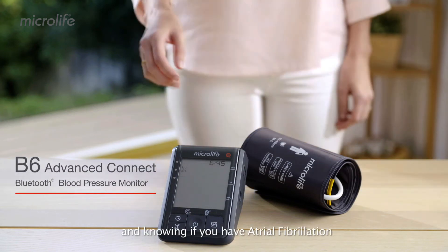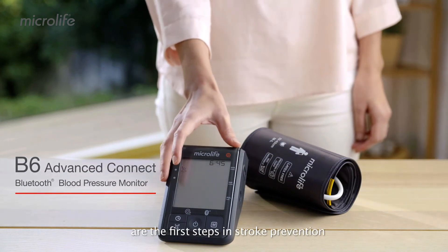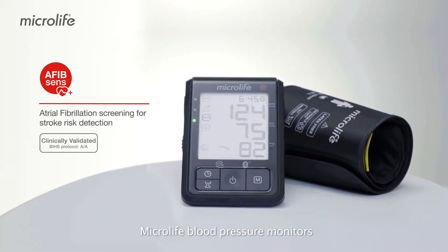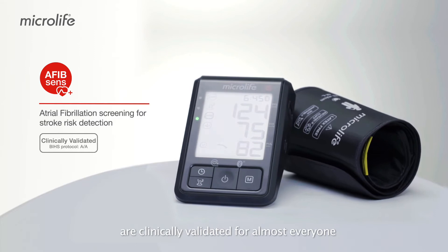Knowing your blood pressure and knowing if you have atrial fibrillation are the first steps in stroke prevention. Microlife blood pressure monitors are clinically validated for almost everyone.